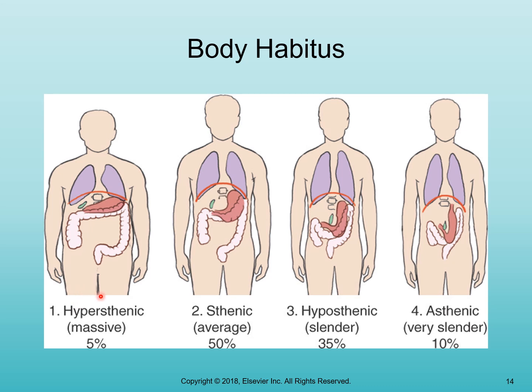We've talked before about how the framework determines where organs lie. We talked about it when we looked at the lungs, when we were imaging the chest. Okay. Now that we're looking at the upper GI system, we tend to look a little bit more at the stomach. So in a hyperstenic patient, the stomach sits more horizontal in that type of patient versus any of the other.